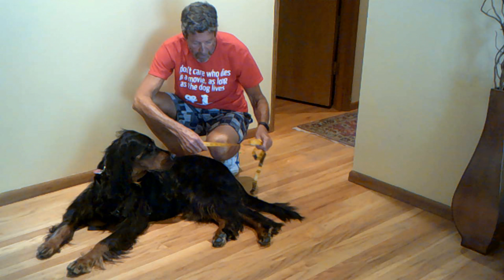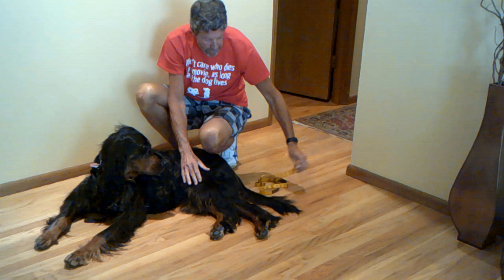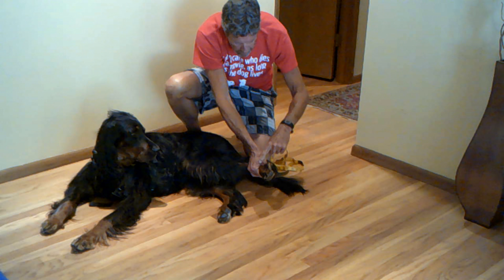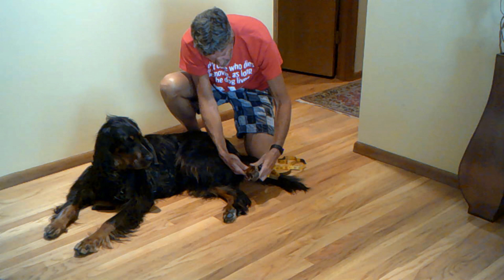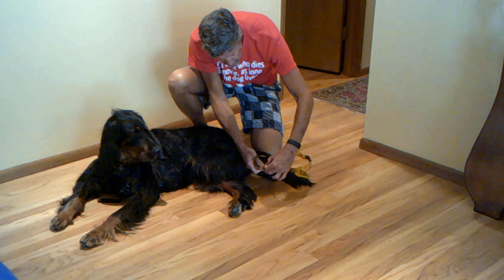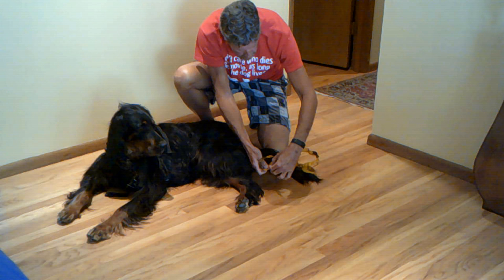Now we're going to measure Brody's paw for the paw strap. The first measurement we want to take is the lower leg right above the paw, and for Brody that measurement comes up to 5 inches.